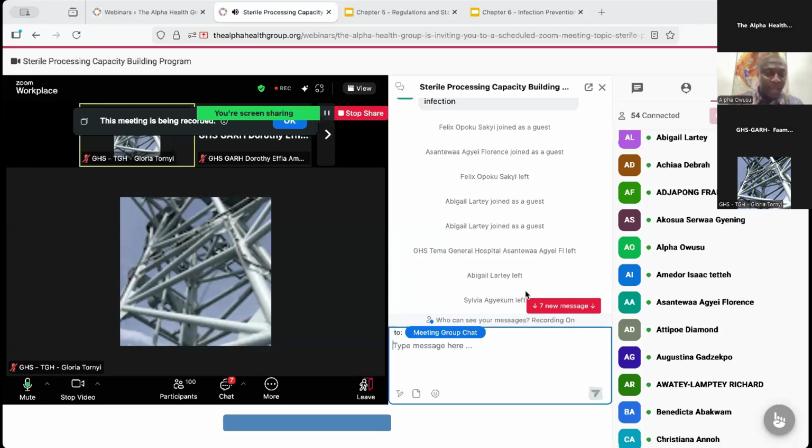And then from there, you assemble it. You put your chemical indicator in there. You do your tamper locking, like you are cooking, and then you finish, you cover it. And then you make sure you don't open it for flies to go in there. And so from there, you put it through the sterilizer. You make sure the barrier of your packaging is preventing infection.